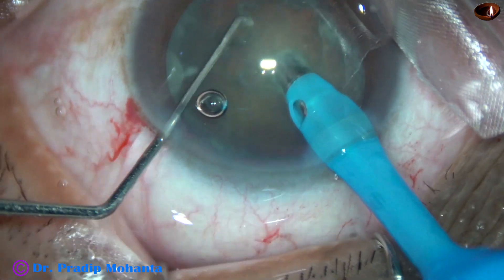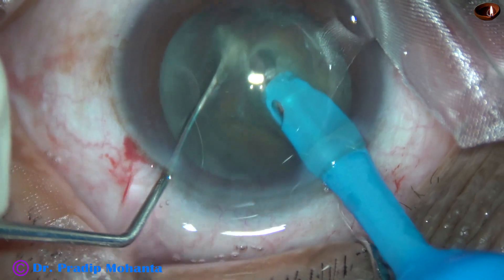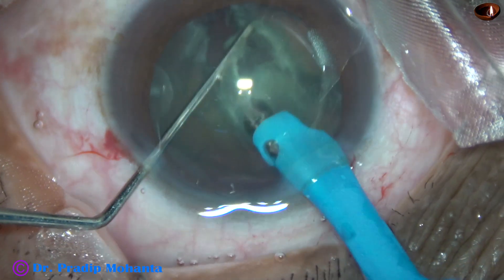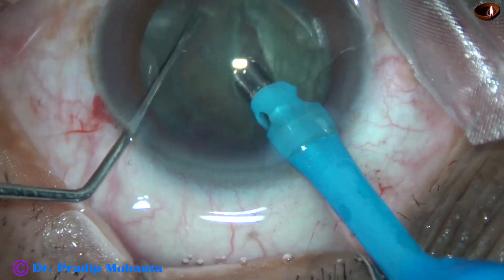Some superficial cortical lens matter is removed. Now in the beveled down position itself, the tip is buried into the substance of the nucleus, and the nucleus is chopped into two heminuclei.